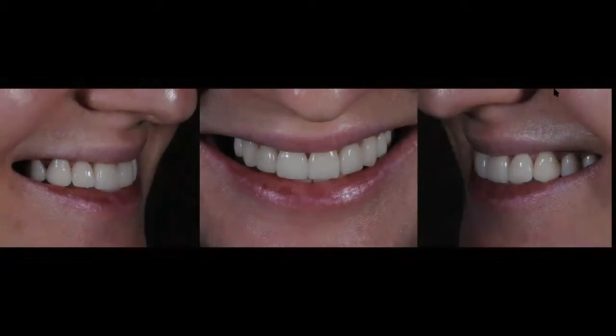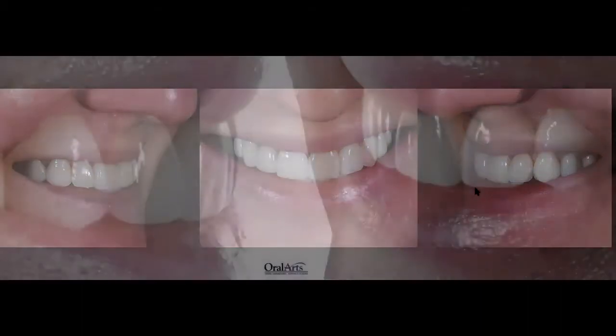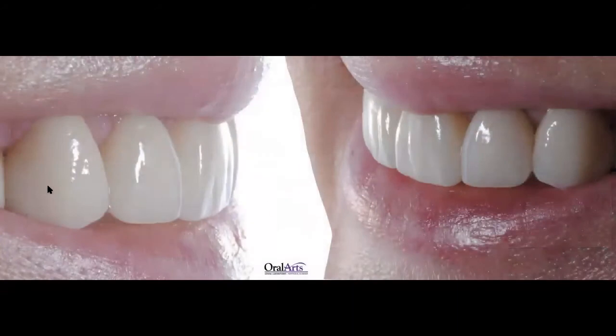And again, on this right hand side photo, you can see the difference in opacity between my premolars, and a slight difference between the premolars and the canine, because the canine is a more translucent zirconia compared to the one that we chose for the premolars and the molars for this specific case. So again, I want you to keep that in mind. But if you look at the anterior teeth and you look at this zirconia, even though it is zirconia, even though it's not as translucent as lithium disilicate, you are able today, by selecting the right zirconia and making sure that your lab understands this, and that you inform them that this is what you're looking for, you will be able to get this type of results.